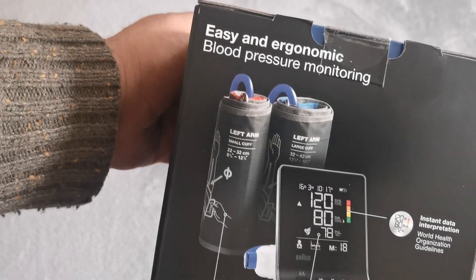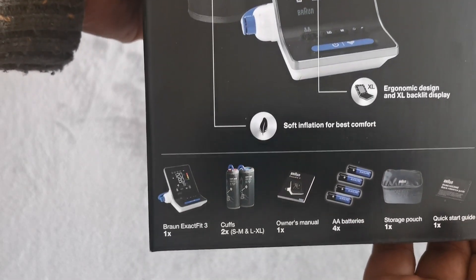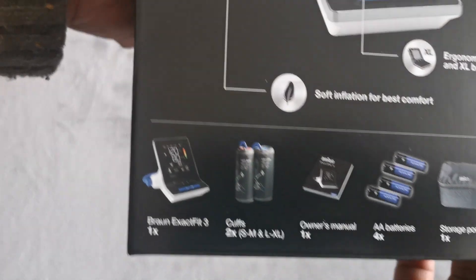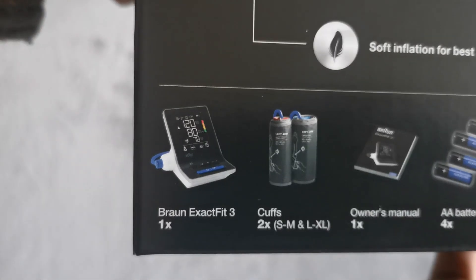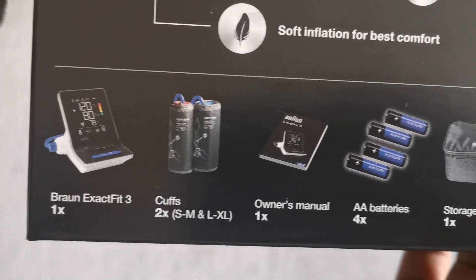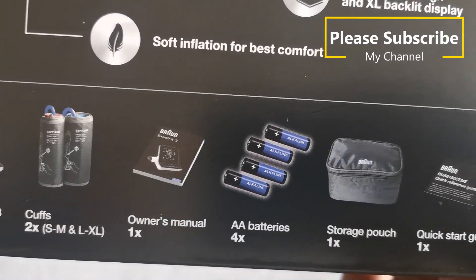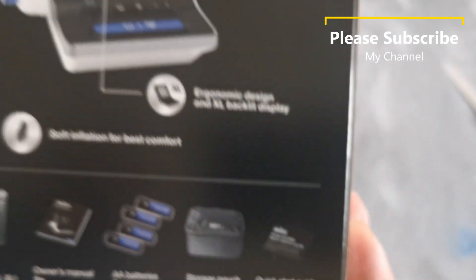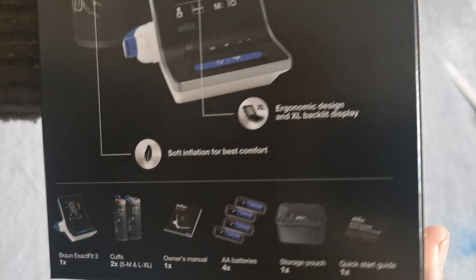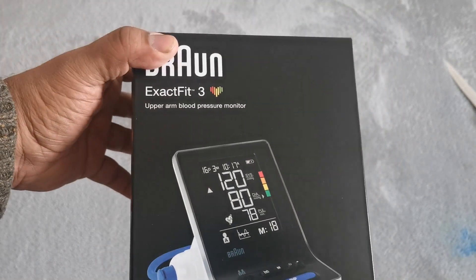So let's find out what we have inside. We got one blood pressure monitor, two cuffs, owner's manual, four AA batteries, storage pouch, and a quick start guide. Pretty good. Looks like it's a good product. Let's unbox it.